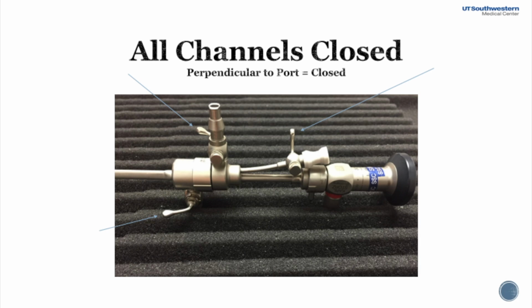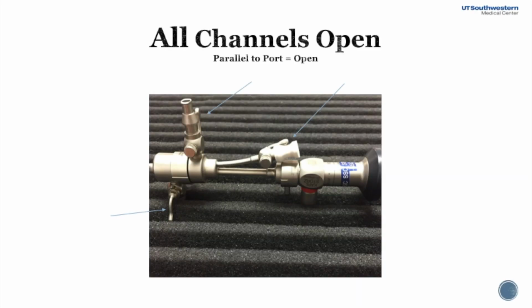You will now be instructed to open and close various channels by manipulating the tabs on each port. As demonstrated in this photo, a channel is closed when the tab is perpendicular to the port. In this photo, all channels are closed. A channel is open when the tab is parallel to the port. Here, all channels are open.